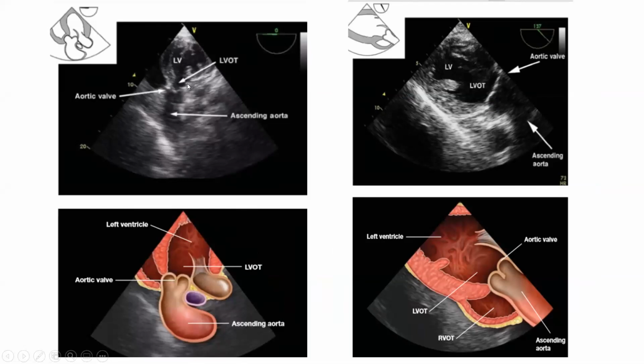Then I will go deep with the 0 degree. Still in 0 degree, I went back to 0. I get the short axis. I went up, I got the mitral valve. I went down a little bit, I got the papillary muscle. I will go down a little bit deeper, transgastric, till the apex. Then I do anteflexion, good flexion.